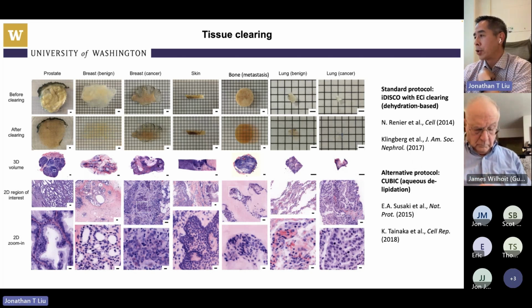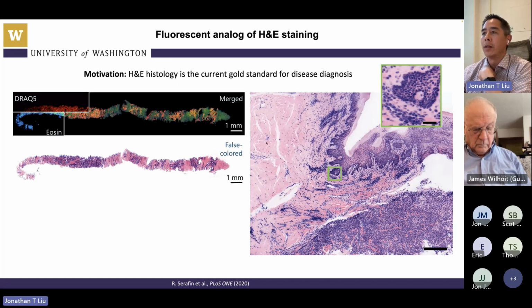So our favorite approach, simplest approach, is just to dehydrate the tissues and replace the water with this high index cinnamon oil, ethyl cinnamate, which is very safe food grade cinnamon oil. There are ways to do it better. Some tissues are harder to clear. They're maybe lipid-rich, fatty tissues. You can even clear bone. You can decalcify the bone. Some of these approaches require removal of the fat, delipidation, and then you can make the tissue very homogeneous in the index of refraction. So there's been a lot of work that's been done in that field.